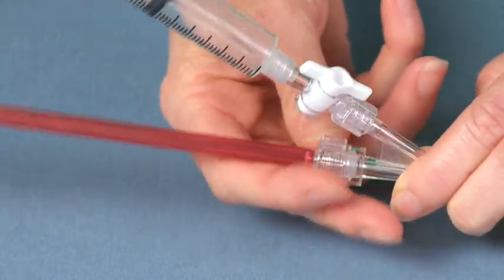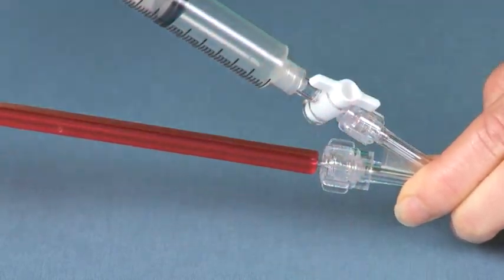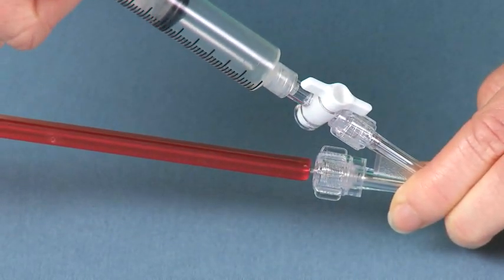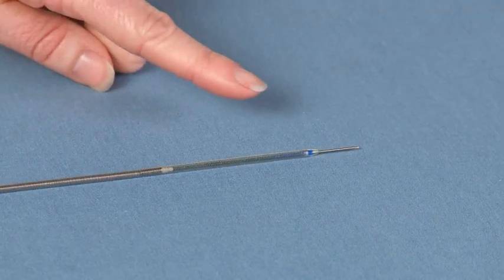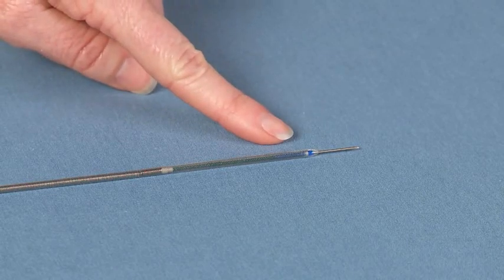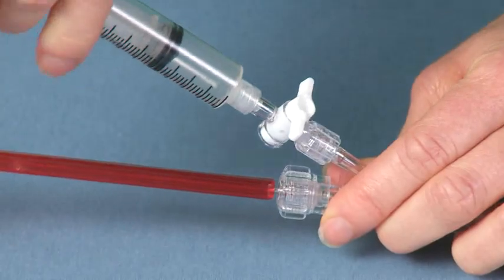While keeping the syringe in place, tighten the Tuohy-Borst valve on the Y-injection adapter by turning it clockwise. Continue applying positive pressure to flush the stent graft lumen until saline drips from the distal end of the delivery system. Close the stopcock when flushing is complete and remove the syringe.